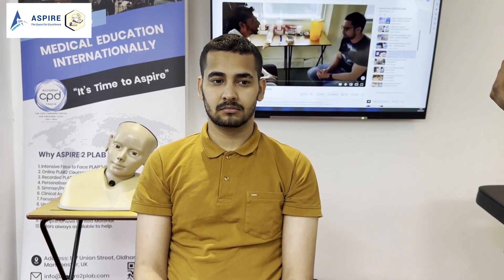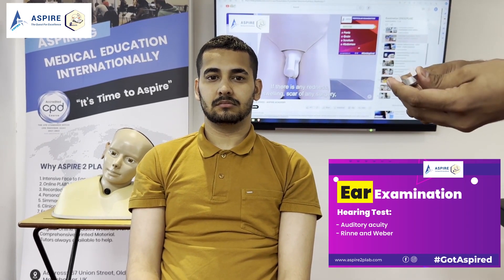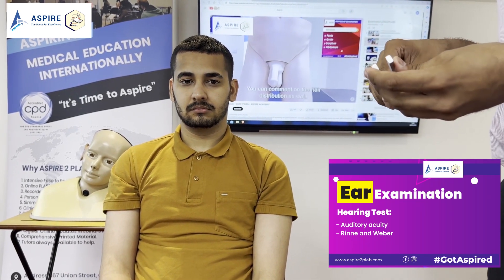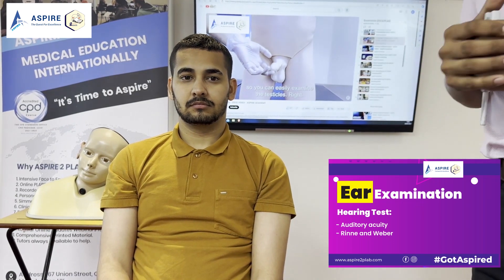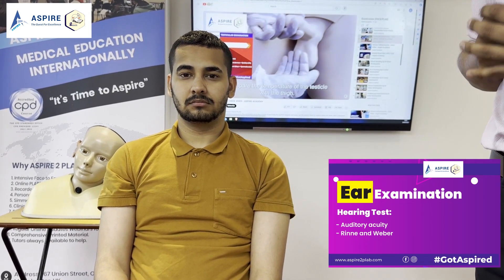Now John, let's do Weber's test. I'm going to buzz it again and this time I'm going to place it on your forehead. You have to tell me if you can hear on the left side, right side, if you don't hear at all, or if it is the same on both sides. Tell me where you can hear. Left side. So, air conduction more than bone conduction in both ears and Weber lateralizes to the left side — this means my patient has got sensorineural hearing loss on the right side.